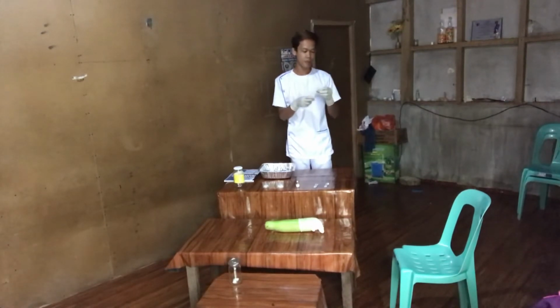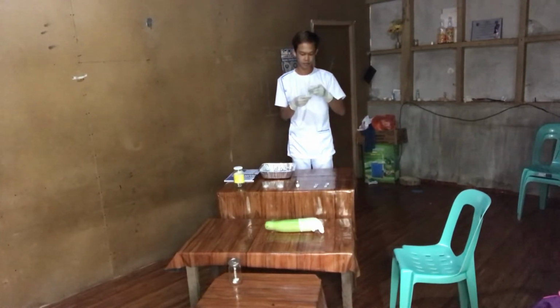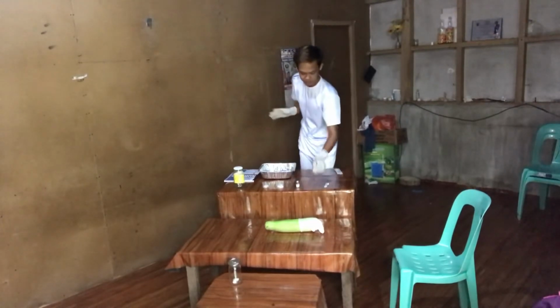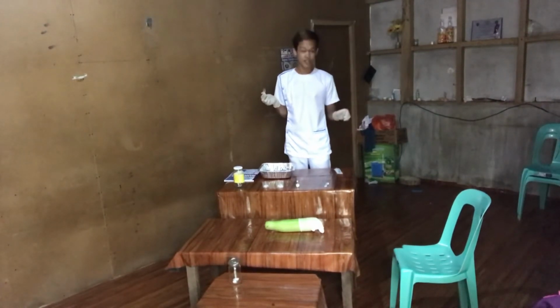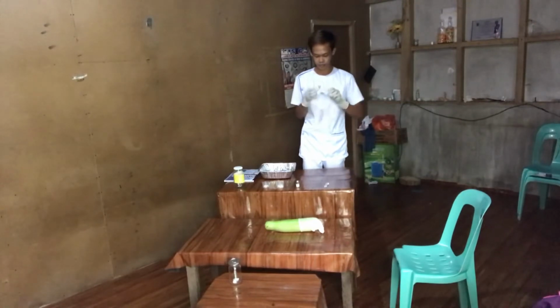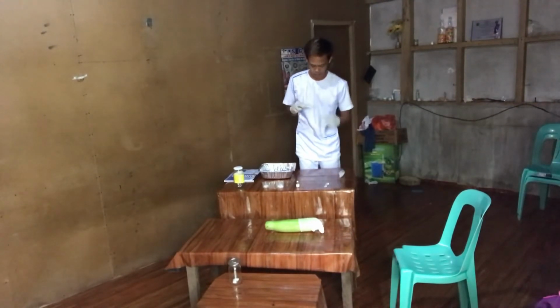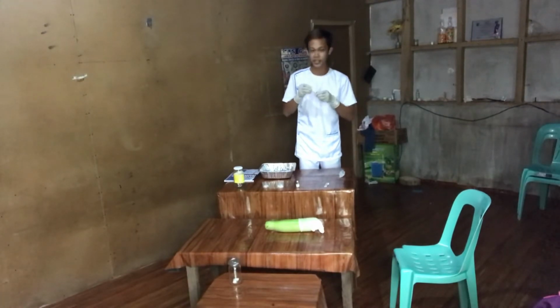We have to open the sterile package, and also open the aspirating needle. Then we're going to connect the 23 gauge syringe to the aspirating needle. Secure that the connection isn't loose.